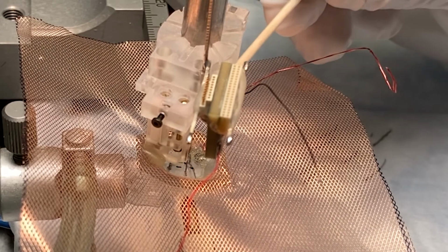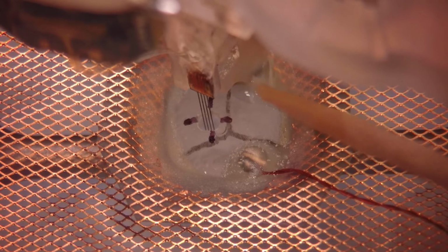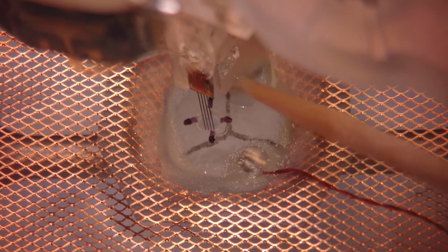Then you apply cement on the other side. One extremely important thing is that you want to fill up the space between the shell component and the skull as much as possible. Here you can see this hole before, and then it's filled with cement after.